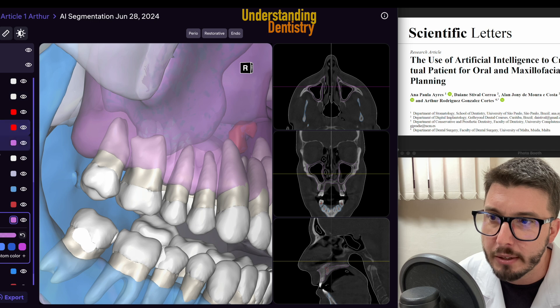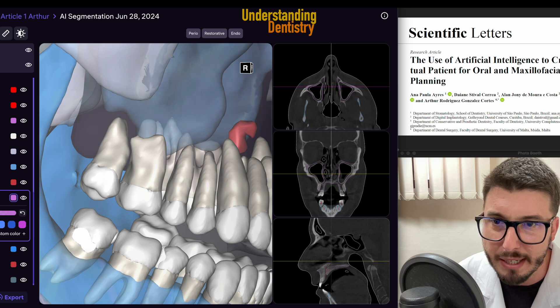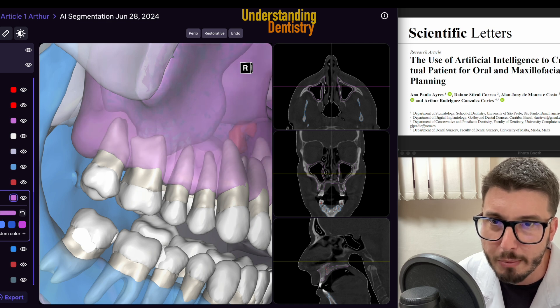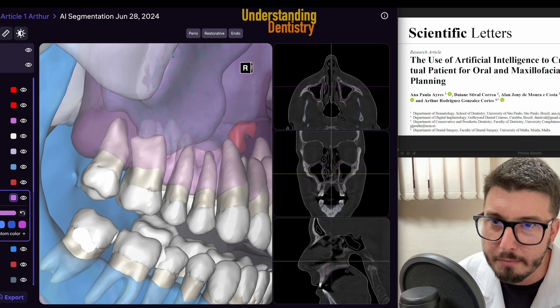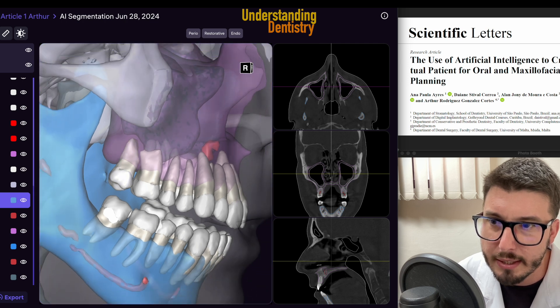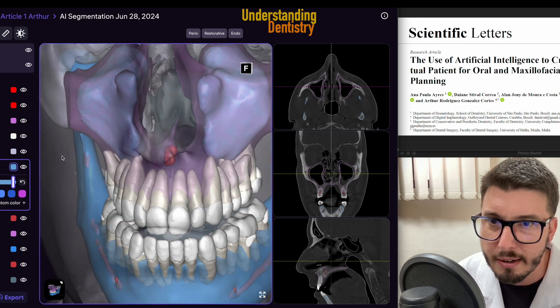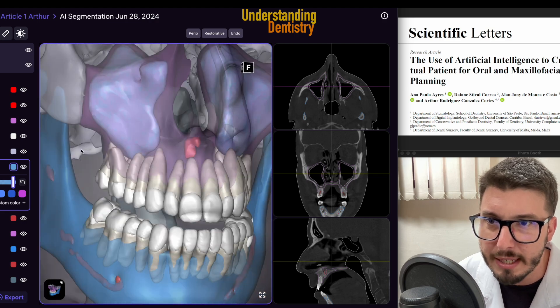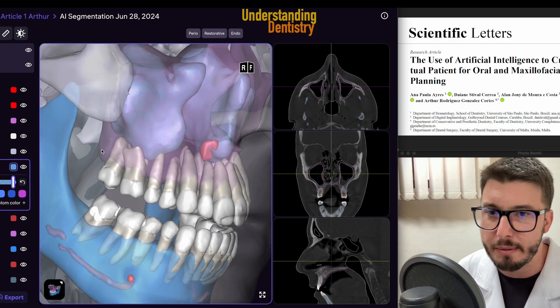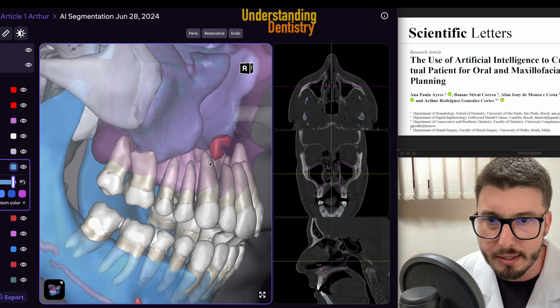Let's go with anatomy now. Let me decrease the intensity of the maxilla — I can even remove the maxilla or make the bone contours more visible. Then we have the maxillary sinus. Both sinuses are in blue here, very visible. That's the entire volume of the sinuses in blue within the pink area of the maxilla. Then we have the nasopalatine canal — take a look at this in red.